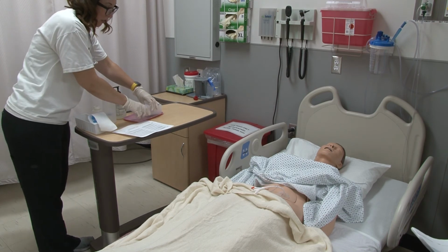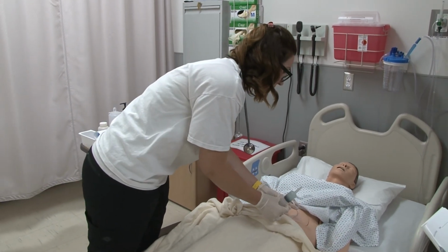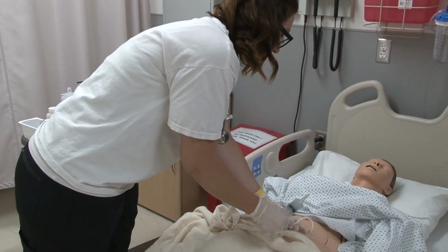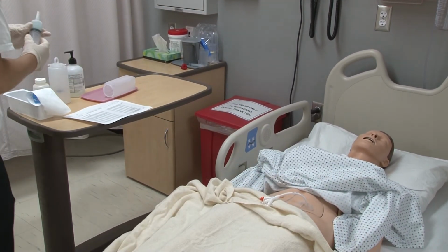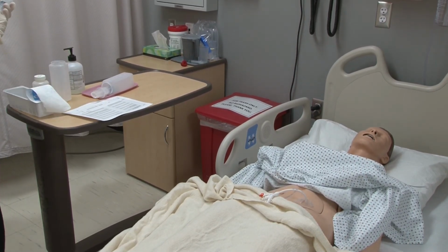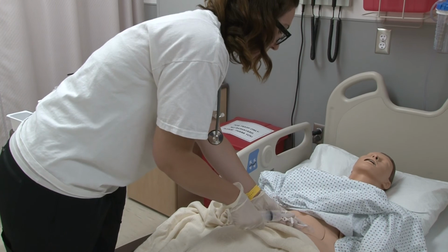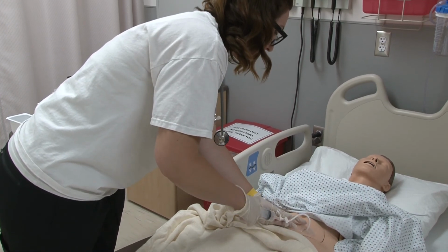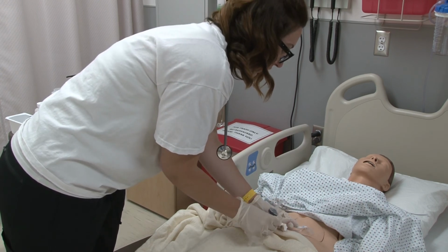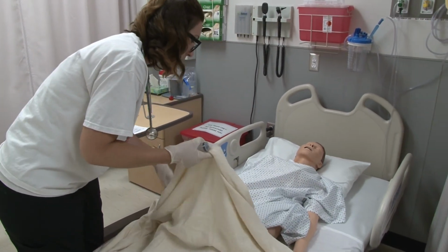Again, it's Cardi 60 milligrams and Pred 10 milligrams. Okay, so here I'm just going to verbalize that I'm going to give your medications. I'm not actually going to flush it through the mannequin Gtube. Okay, so that's administered. Then I'm going to go ahead and follow it up with a 20 ml flush. Again, I'm just verbalizing it because we're not actually flushing fluids through the Gtube. Okay. Very good. So all of the medications are in, your flush is in, your Gtube is closed off and clamped. I'm going to go ahead and cover you back up.